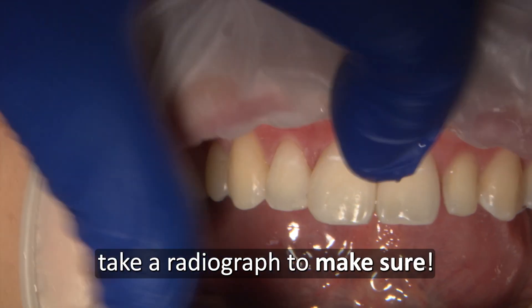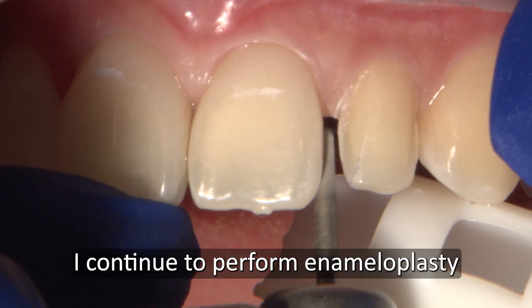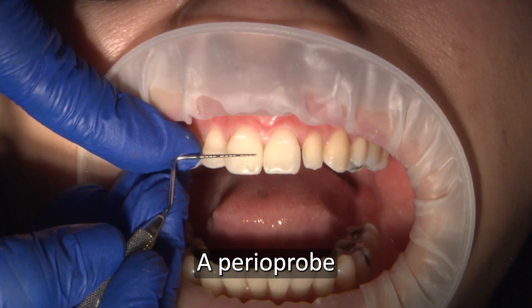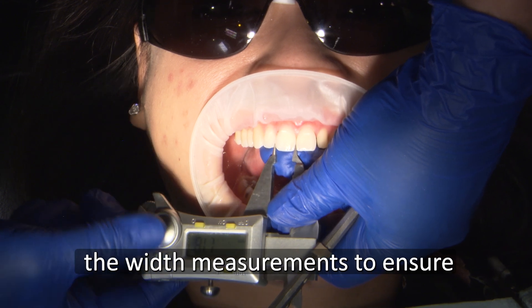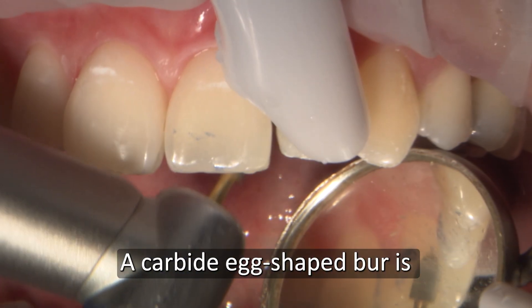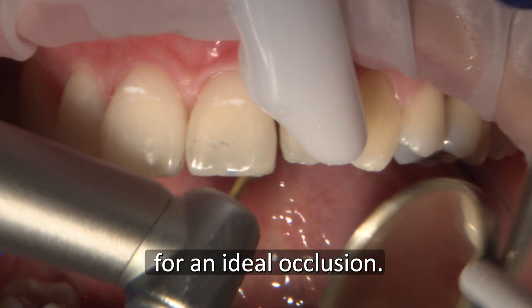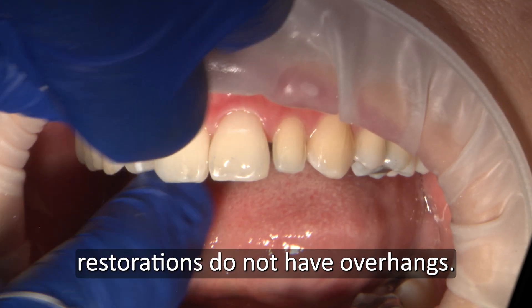If you aren't sure, take a radiograph to make sure. I continue to perform enamelplasty as the cosmetic composite restorations start to take shape. A perioprobe or electronic digital caliper can check the width measurements to ensure symmetry of numbers 8 and 9. A carbide egg-shaped burr is used to adjust the lingual aspects for ideal occlusion. I recheck with floss again to ensure restorations do not have overhangs.